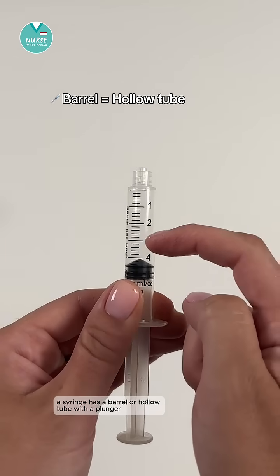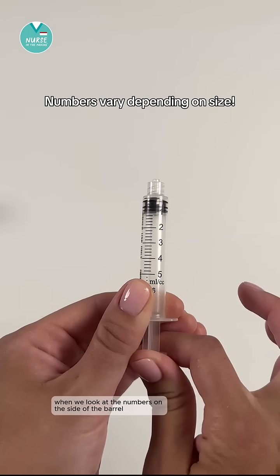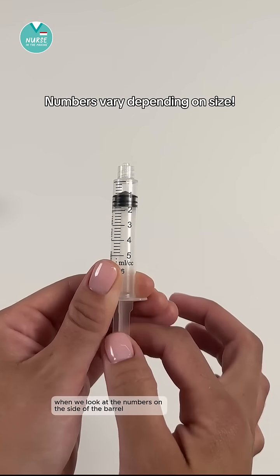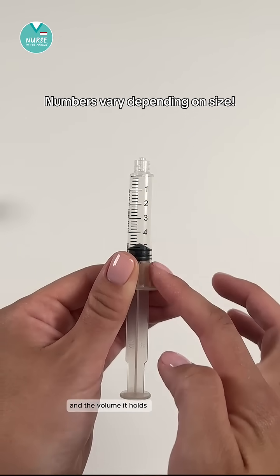A syringe has a barrel, or hollow tube, with a plunger which moves up and down when pushed or pulled. When we look at the numbers on the side of the barrel, they will differ depending on the size of the syringe and the volume it holds.